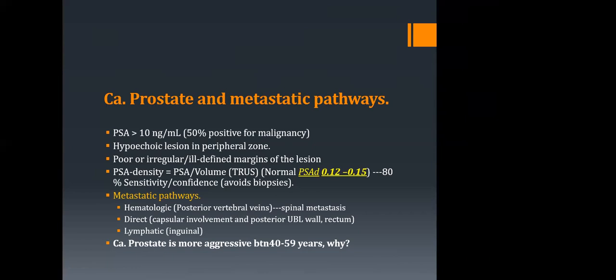That is if you have ruled out any other causes of cancer, because metastasis can go anywhere, from the liver, it can be colon, it can be from the stomach. And then we have direct invasion. Direct, you have the prostate. This is why we are emphasizing, look at the capsule of the prostate.